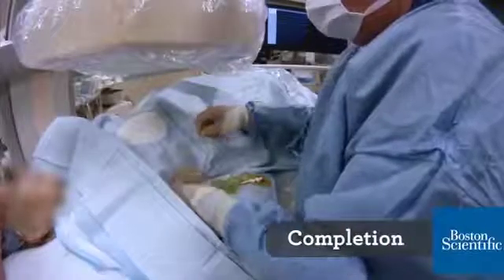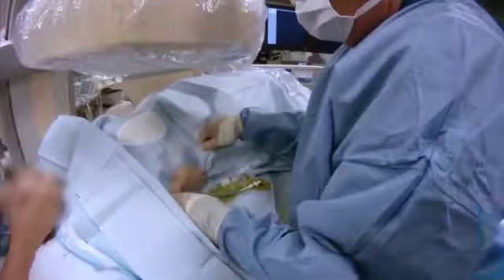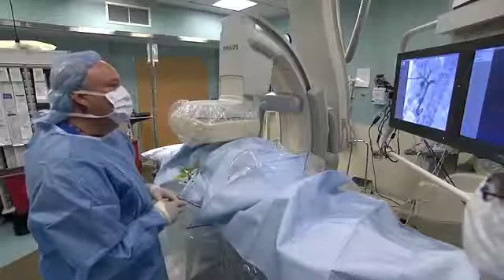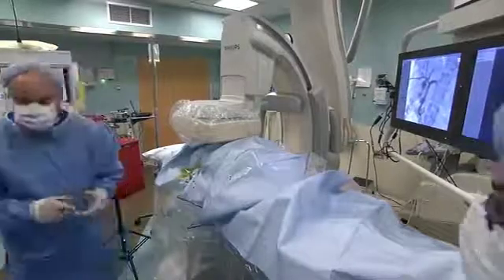To secure the catheter and prevent migration, I suture around the catheter and the patient's skin. I then inject some additional contrast to ensure the most proximal side hole is located correctly in the collection. This also ensures the distal side hole is properly placed. The drainage catheter will be hooked to a connector tube and the exit site will be dressed with an antibiotic ointment, gauze, and a Tegaderm.